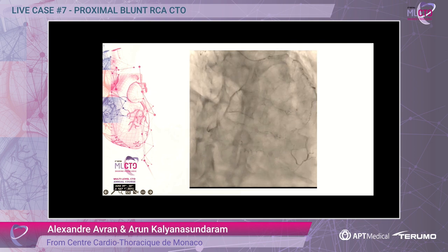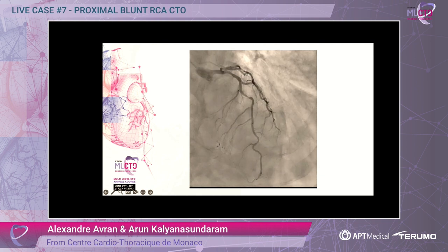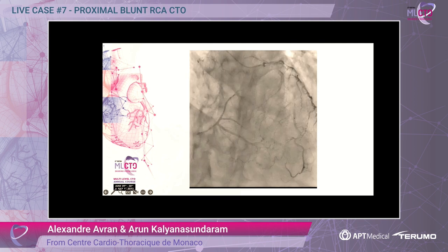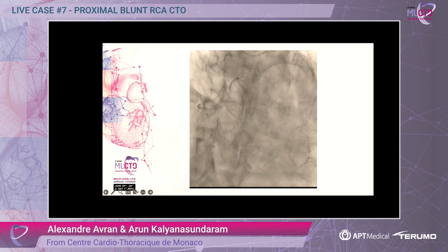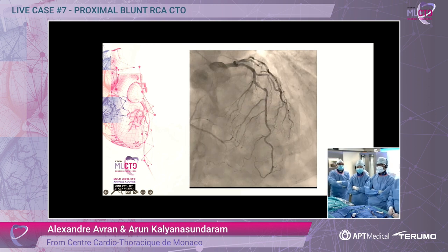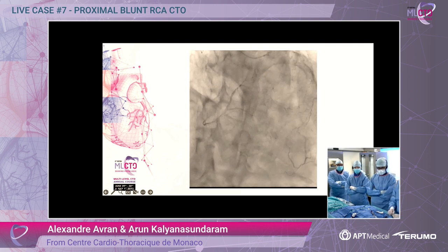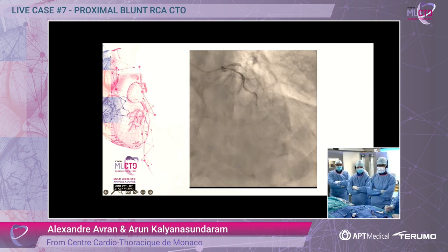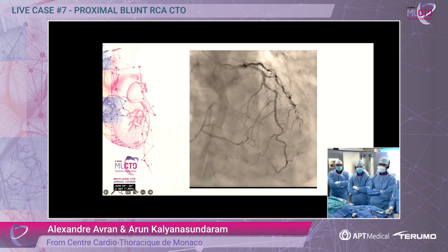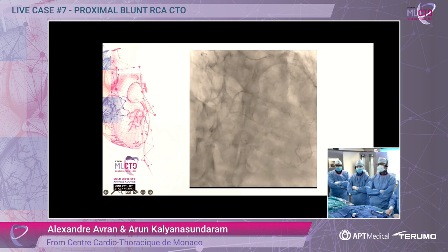For the setup, Arun, we decided to work with two 7 French guides. Fortunately, we succeeded on femoral because there was no radial pulse anymore — it was going to be brachial or femoral. So we have two 7 French: Amplatz Left for the right coronary and EBU 3.75 for the left coronary. We will show you the dual injection.